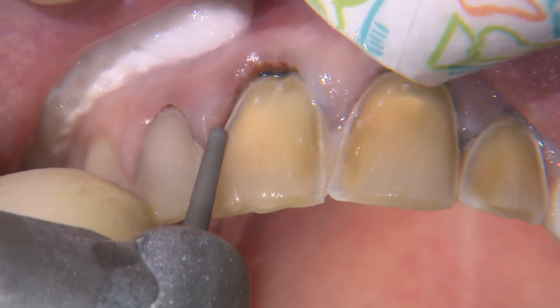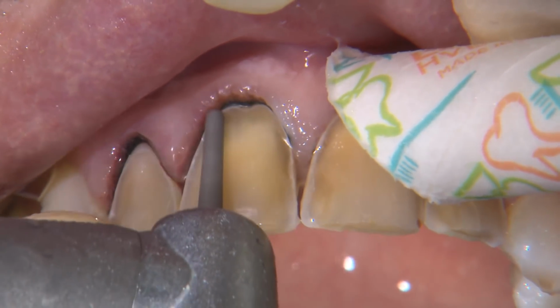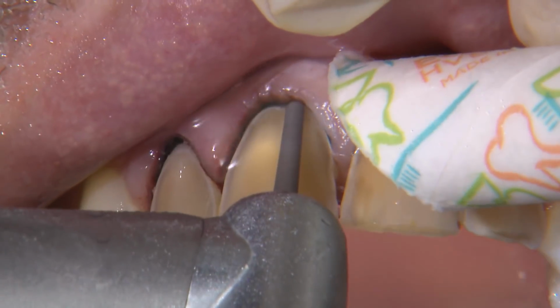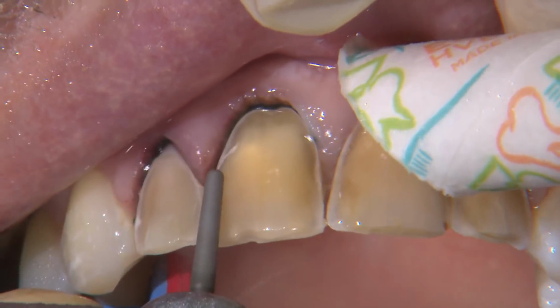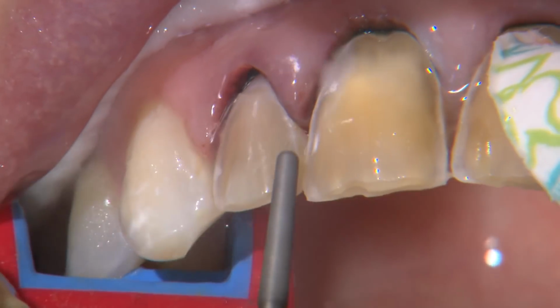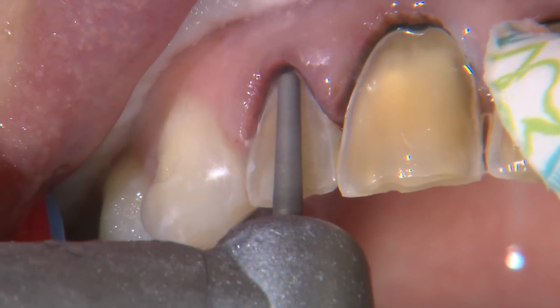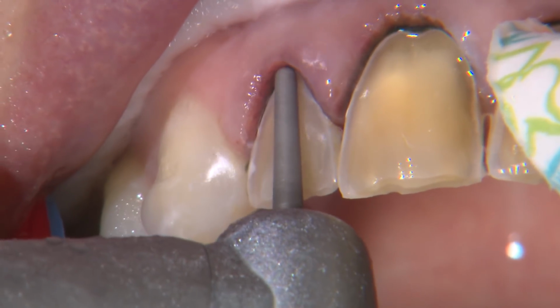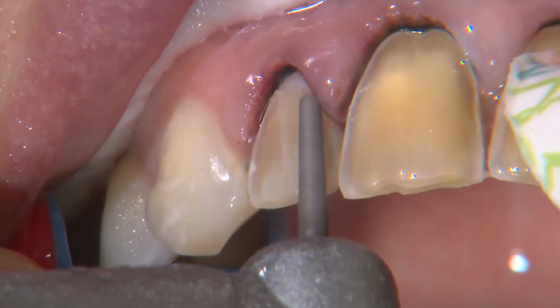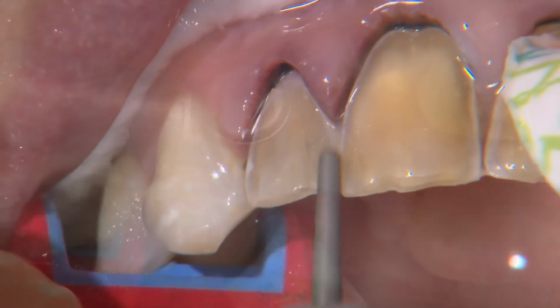I use the same round-ended tapered diamond to reduce the prep so the margins run along the soft tissue equigingivally. The tip of this burr is approximately 1.2 millimeters in diameter, so I run it along the margins until nearly half of the burr is placed into the tooth. This will help create a clear chamfer along the margins and allow for a uniform thickness of the final restorations in these areas. To follow the mesial to distal curvature of the anterior teeth, I run the tapered diamond burr interproximally to a depth of about halfway into the contact area.